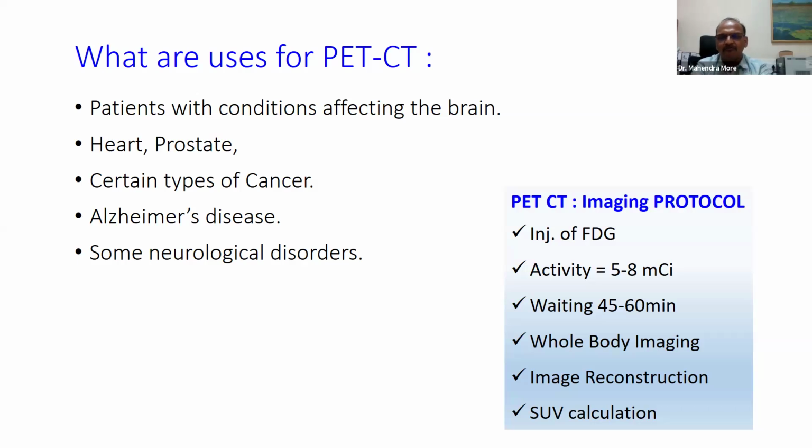Again, the same principle for the calculation of the SUV: you also require how much activity you injected. So they take a syringe count, an initial pre-syringe count, then they inject it, then we take a post-syringe count. We come to know how much is the activity injected into the body, then how much is the uptake in that particular organ, and what is the BMI of that particular patient, the height and body weight. It gives the BMI, and from those we get the SUV calculation. So basic studies which are performed under PET are mainly in the prostate and whole body staging of the cancer disease.